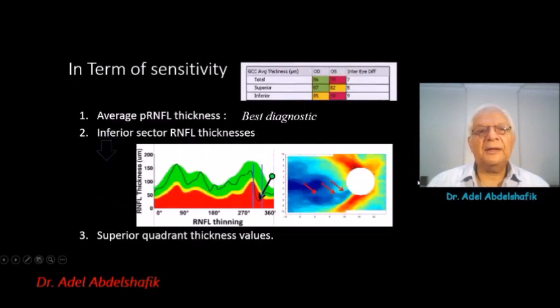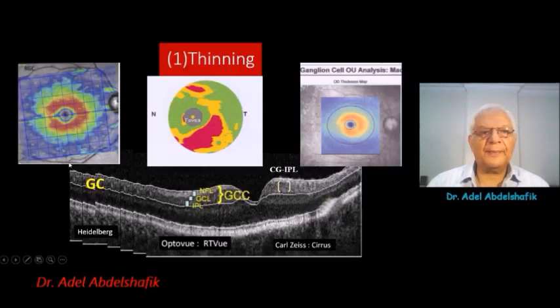person. For diagnosis of glaucoma, decrease in the average thickness of the nerve fiber layer is the most diagnostic sign, but still you will have changes in the lower temporal zone. This comes next in the frequency of diagnosis, and lastly in the upper temporal zone.